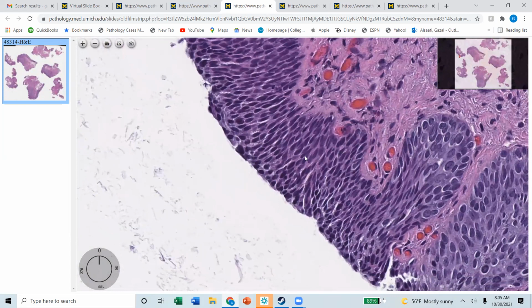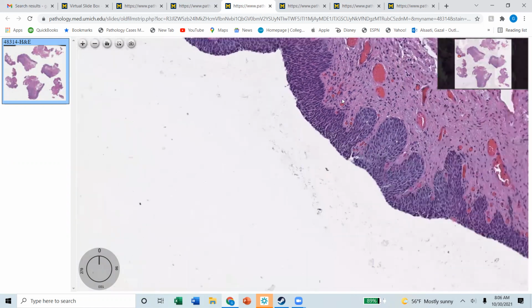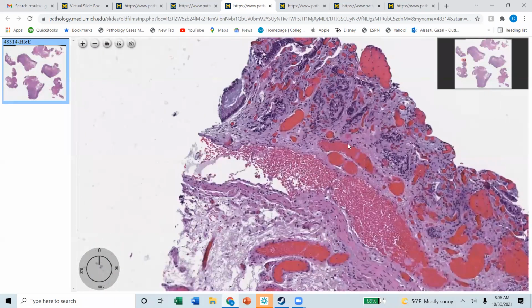What I usually do for my AINs is either condyloma acuminata, which is AIN1, or I would do AIN2-3 on my biopsies, because I'm telling the clinician that I found my mitosis in the middle. Doesn't mean that I didn't find it in the third, but it's middle and third. The reason I joined them together is because they're managed the same way. And you don't have to commit yourself right away to all of that. You can just call it AIN.